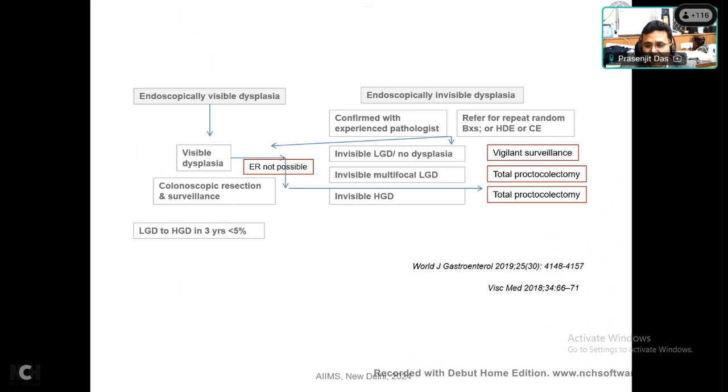The dysplastic lesions can be polypoidal or flat. Polypoidal lesions are easily visible on the endoscope, and usually they can do chromoendoscopy, spray methylene blue, and go for colonoscopic resection even without histological confirmation. But whenever the dysplasia is flat, in follow-up biopsies, that is your domain. The most important message I want to give is that whenever you are looking at any follow-up biopsies, along with our basic questions like architecture, type of inflammatory cell, and basal plasmacytosis, you also have to see if there are complicating factors or not.